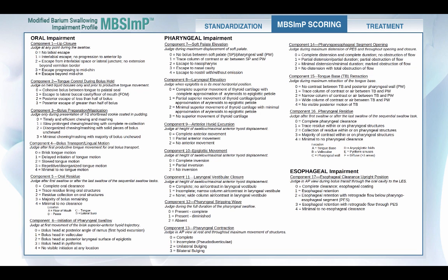Remember, the components contained on the MBSImP were included based on scientific evidence that they met the test for both validity and reliability in patients who were dysphagic.